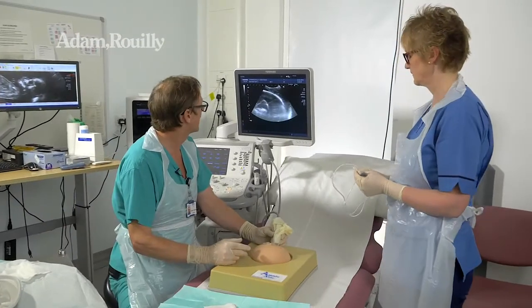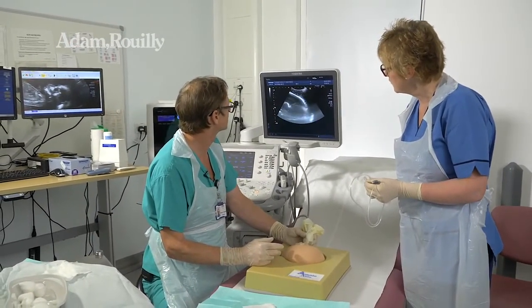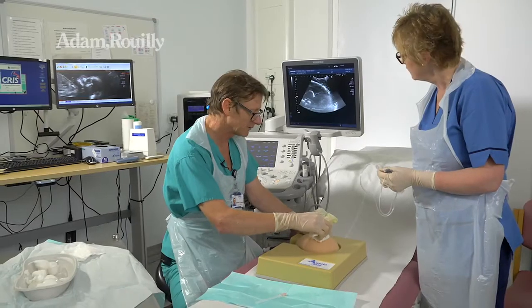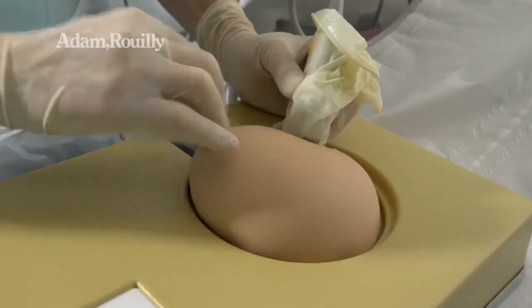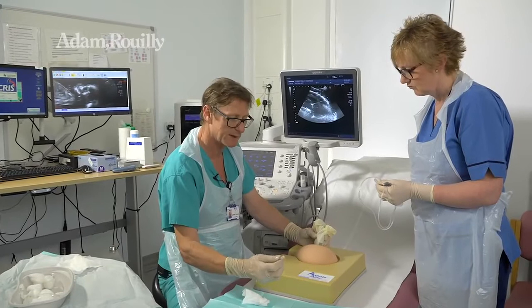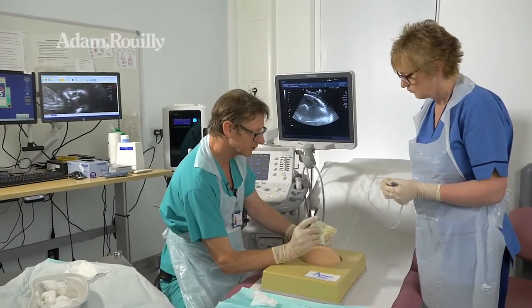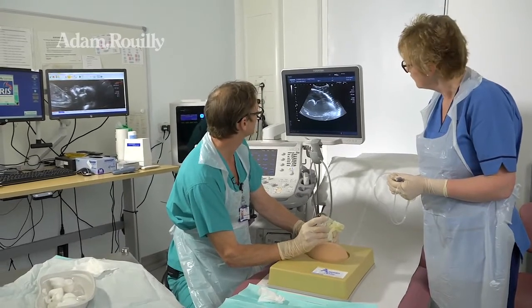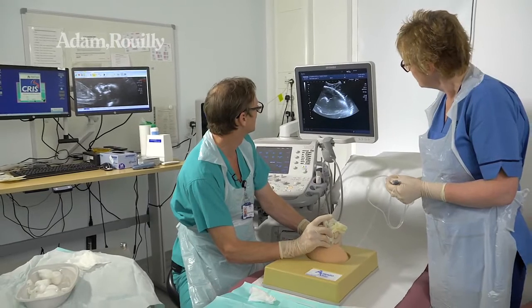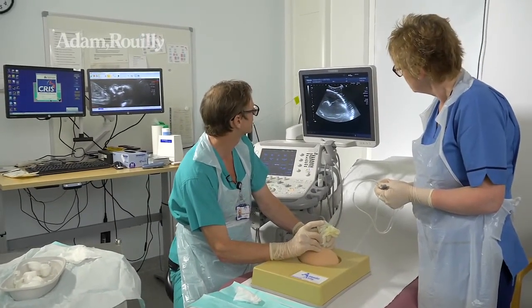I'm just going to scan. I can see the fetus, I can see the abdominal wall, and I can see a nice puddle of liquor to aim for. So having marked the spot, I'm going to remove the cleaning gel, the lubricant gel, to provide a sterile area. And I always do an amniocentesis with an assistant. I know many people don't. It just, particularly for the more difficult procedures, makes it easier to avoid that transmitted shake through to the needle tip. So that's the needle going in.